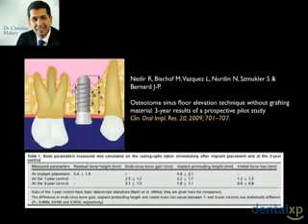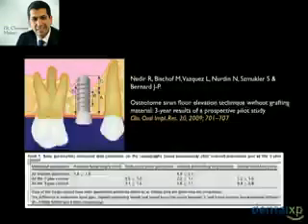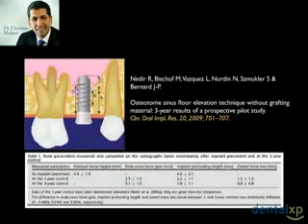A lot of authors are working on this subject clinically. I will go to this publication by Nadir and co-workers in 2009, who showed in a clinical study the 3-year results of this prospective study on osteotome sinus floor elevation without grafting material. And they could gain, at 3 years, a mean bone gain of 3 millimeters without the use of any biomaterial.